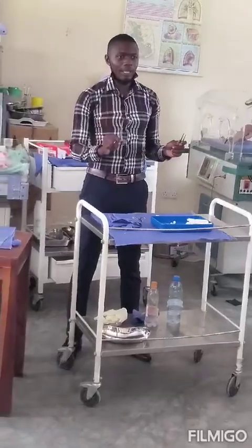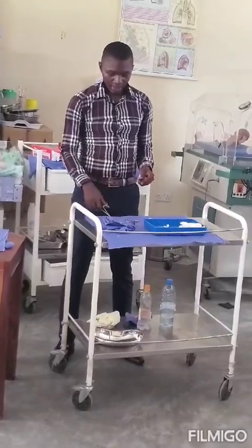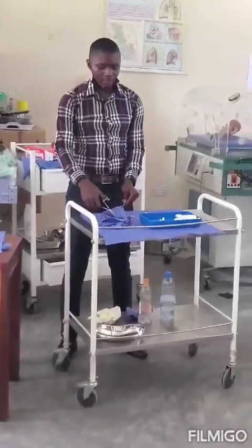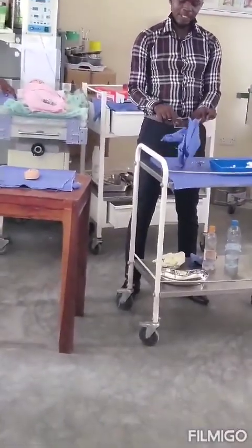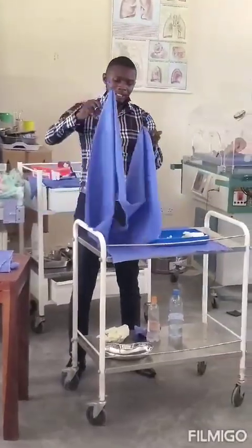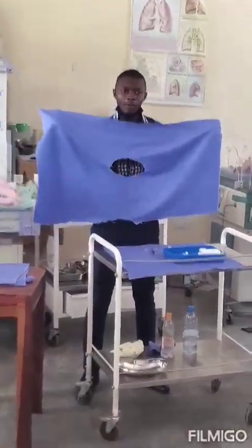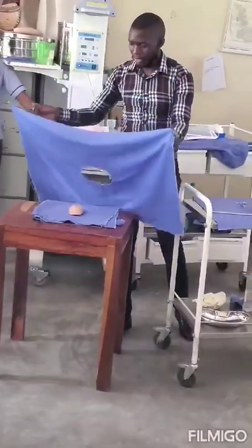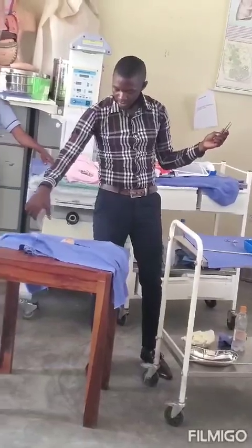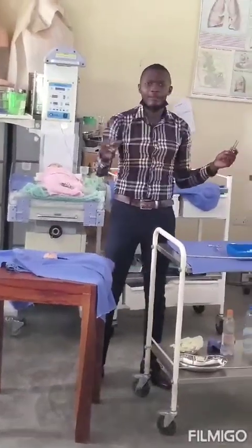Remember I said it's wound care, then after wound care you do what? You suture. So as you start the wound care, get now the drape because now you are ready to move to the patient. So just pick 2 corners and lift it like that and you open up. Don't lift and you start shaking like that. You don't shake sterile things, meaning you have contaminated. Then just come here and drop it on the patient like that. And then if you need to position it nicely, you can still move it. But make sure this hand should never come back to the field.